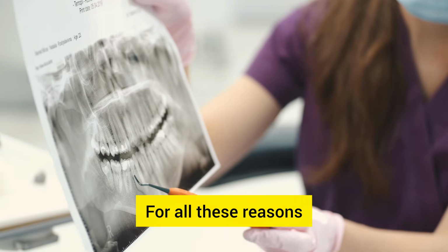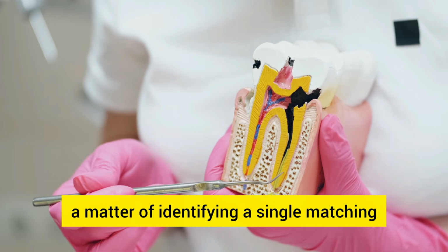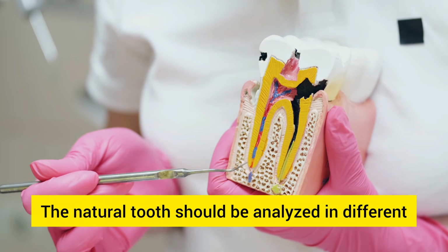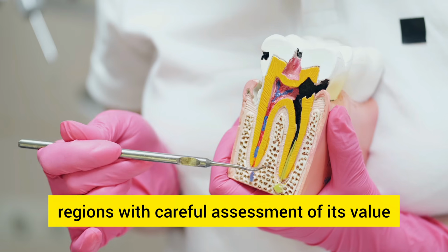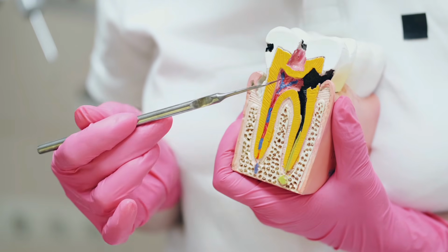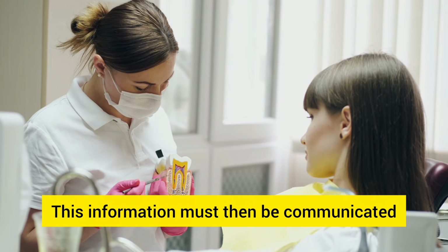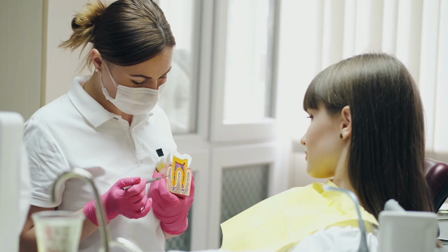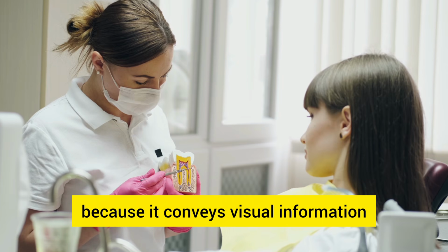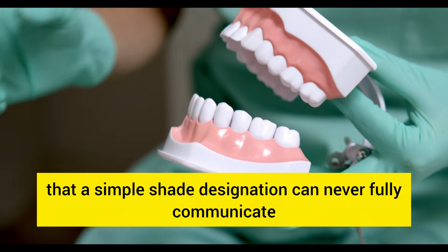For all these reasons, shade selection for a crown is not simply a matter of identifying a single matching tab on a dental shade guide. The natural tooth should be analyzed in different regions, with careful assessment of its value, chroma, hue, translucency, and individual optical characteristics. This information must then be communicated accurately to the dental technician. Clinical photography can be particularly valuable because it conveys visual information that a simple shade designation can never fully communicate.